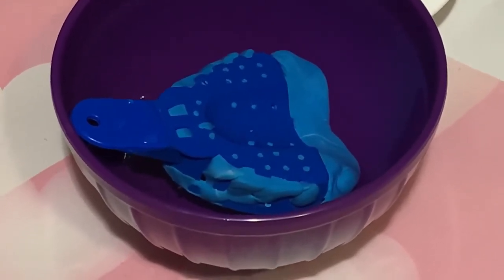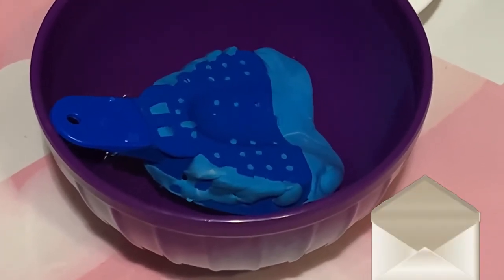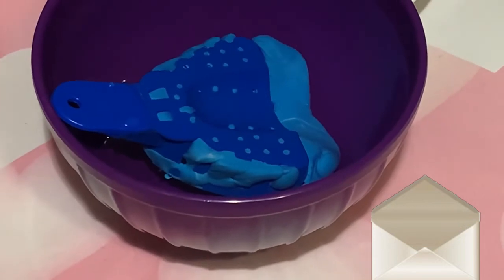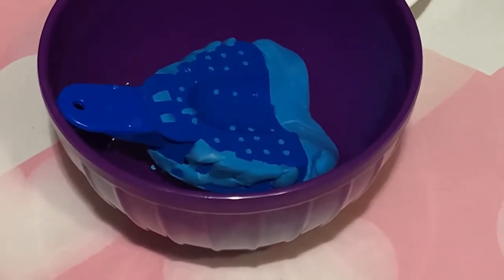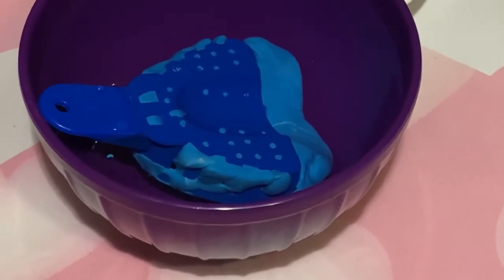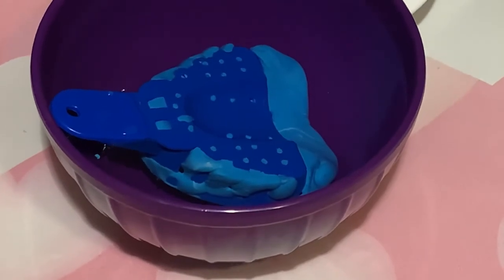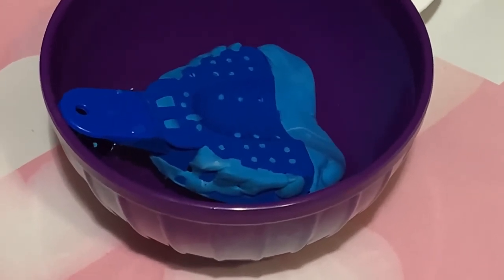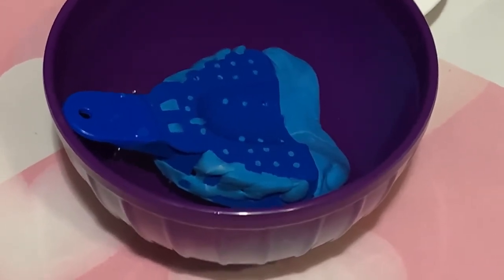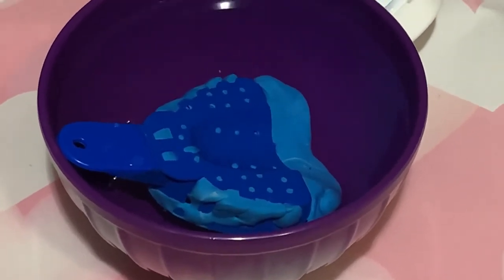And then once you're done, you're going to pop it in the return envelope, which I'm going to put in a zippy bag and then pop it in the return envelope. And in about 2 weeks, you should get your mouth guard. And that's about it. So I hope this helps somebody in case you're nervous, you don't know how to do this.